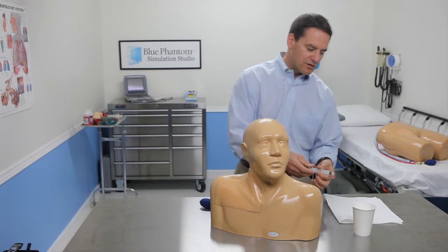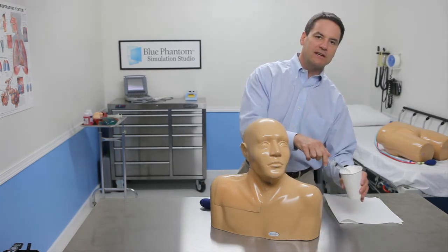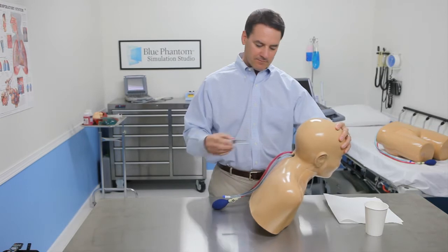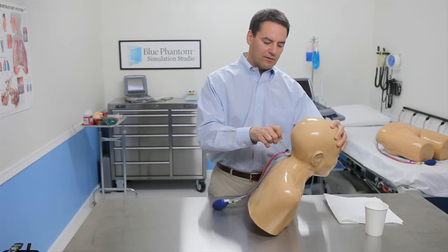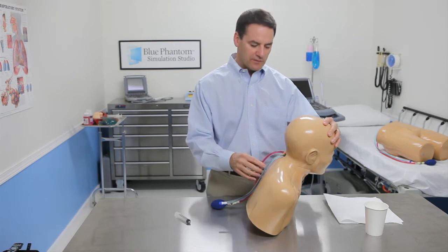What you'll do first is draw up about 10 mils of the soapy water so that you can inject it into the conduits in the back of the insert. I'm going to tip him forward and I'll put in about 5 mils into the back conduit. I don't infuse that into the tubes themselves, just in the space around the tubes in order to make the tube slippery.